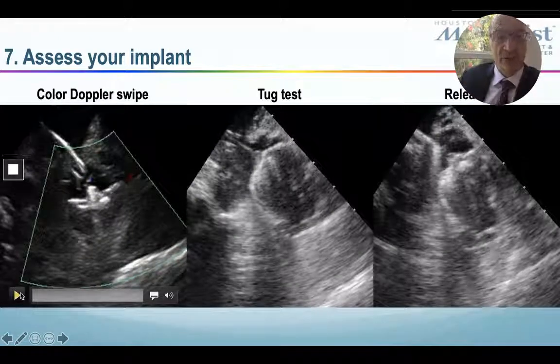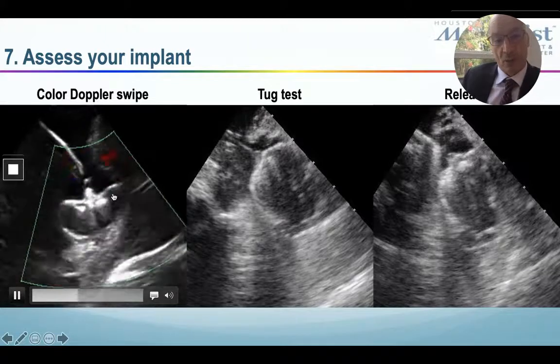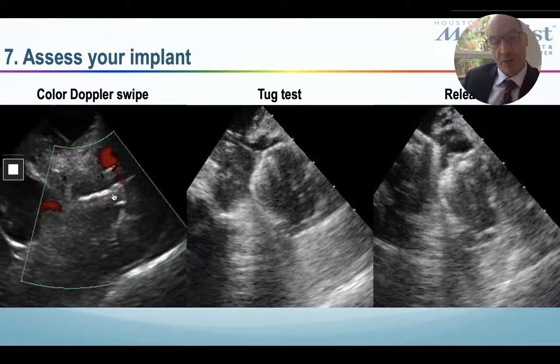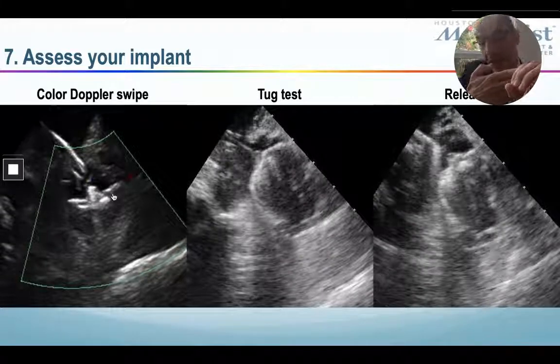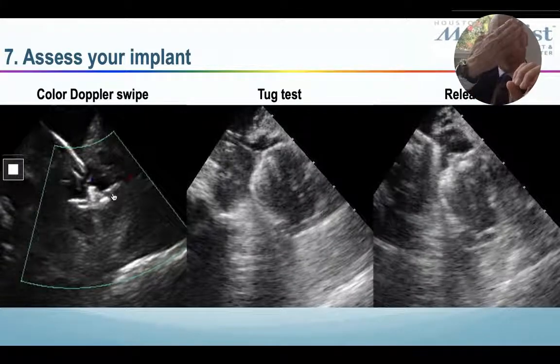So with intracardiac echo, you can use Doppler to see leaks. And in this case, instead of using multiple angles as you do with TEE, where you rotate the angle of your echo beam, we have a relatively fixed angle. The intracardiac echo is not multiplane, so we have a vertical echo beam, but we rotate from posterior to anterior along the Watchman, and we put Doppler, and we can see leaks just the same.